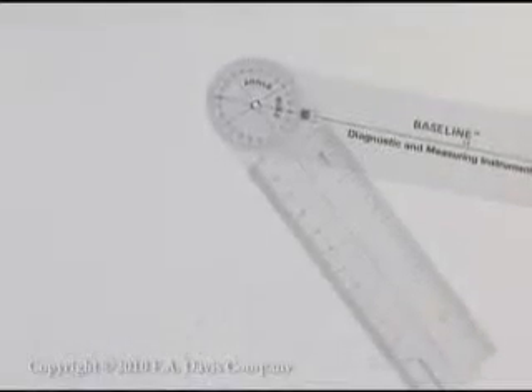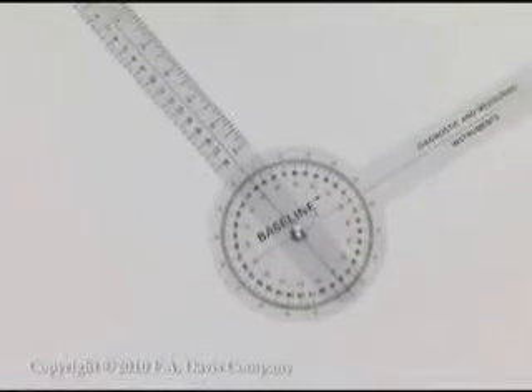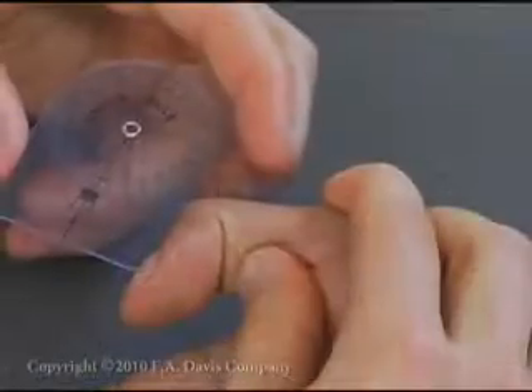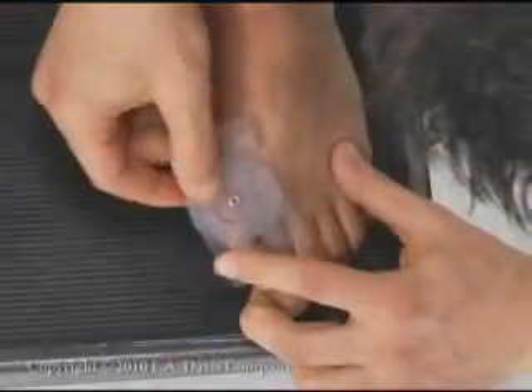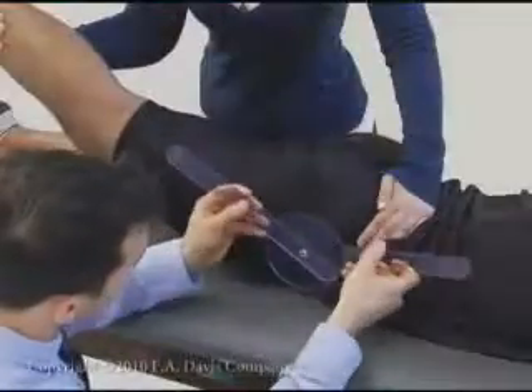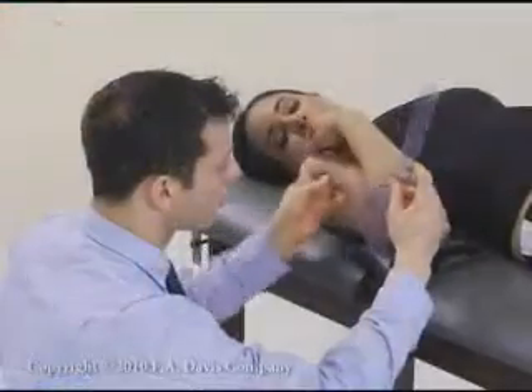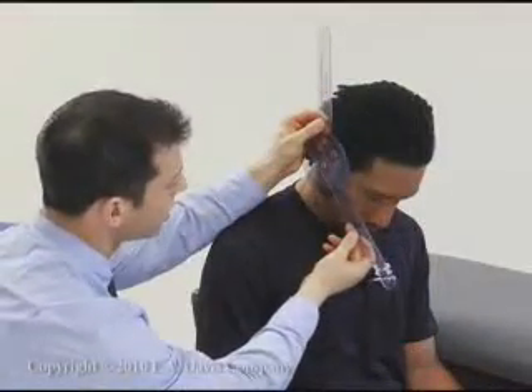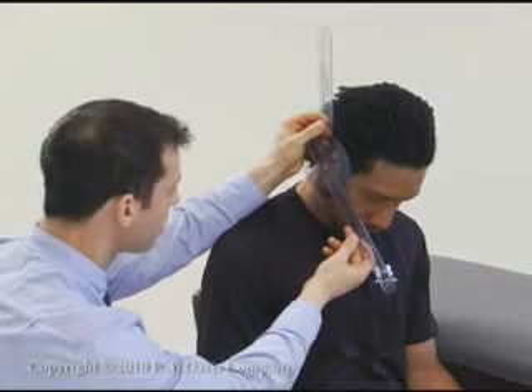The universal goniometer is the instrument most commonly used to measure range of motion. Universal goniometers are available in various sizes; choose the goniometer that best fits the joint being tested. All universal goniometers have an axis placed at the axis of the joint being measured, a stationary arm placed along the stabilized bone, and a moving arm placed along the moving bone.